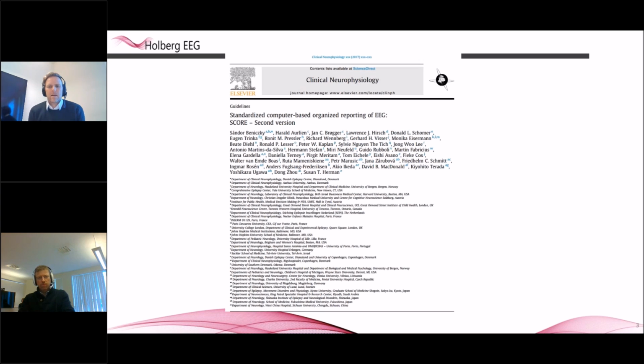Since then, the SCORE consortium has grown to include members in the US and in Asia. With this latest publication, this is the new standard for how to report EEGs. This is the basis for the software that we have developed at Holberg, and also the basis for what we're going to show you here today in the educational platform.